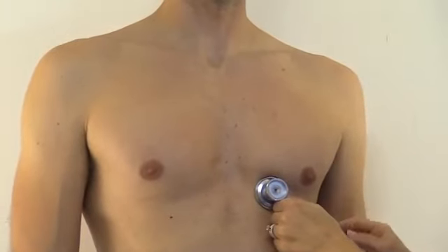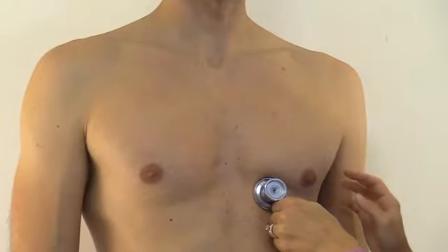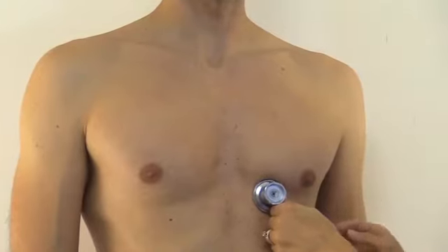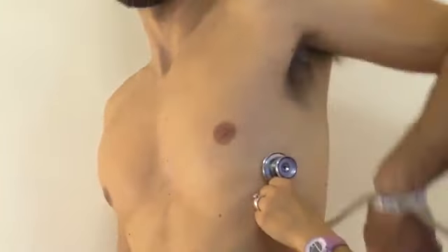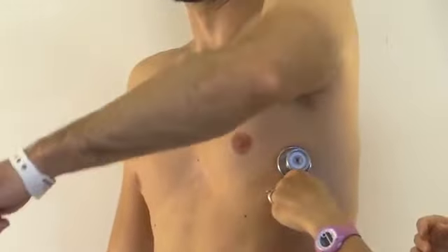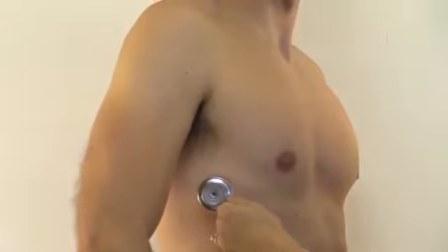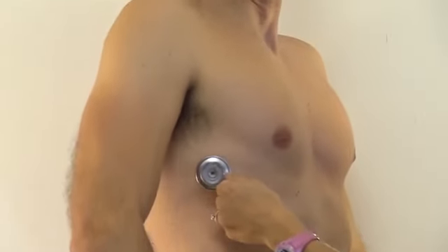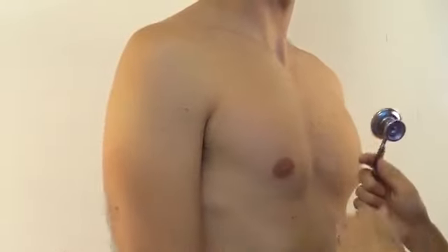Then we're going to go mid-axillary at the sixth intercostal space, and listen to the right and left lower lobes. If you just want to turn to the side right there, take a good deep breath in for me. Okay, other side. Okay, now let's listen posteriorly.